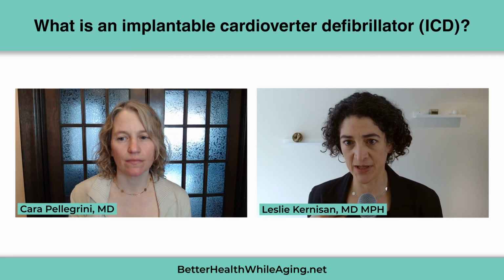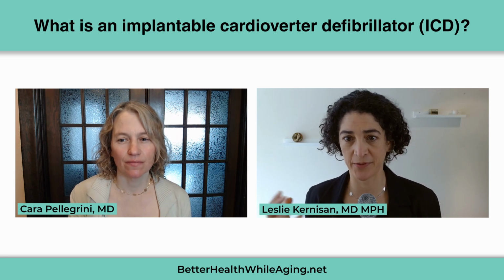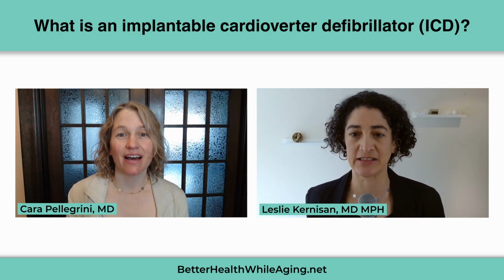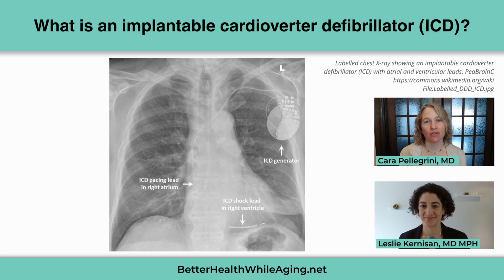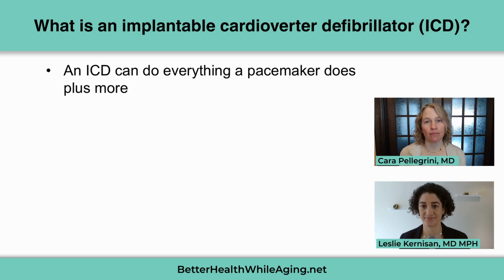And then also I know sometimes when people get a device, there's also something that might shock them. Yeah, an implantable cardiac defibrillator, which people sometimes refer to as pacemakers, but those are not strictly speaking pacemakers. Can you just speak to what that is and how often are they combined with pacemakers? Yeah, great point. So there's yet another family of what's called a cardiac implantable electrical device, and that's called an ICD, or implantable cardioverter defibrillator. ICDs do everything that pacemakers do. These ICDs are generally able to pace the heart, to keep the heart rate up if needed. But the indication for these devices and the extra feature makes them special.